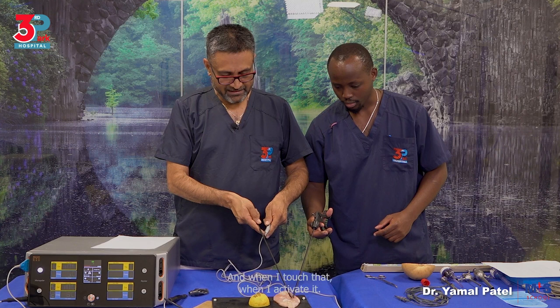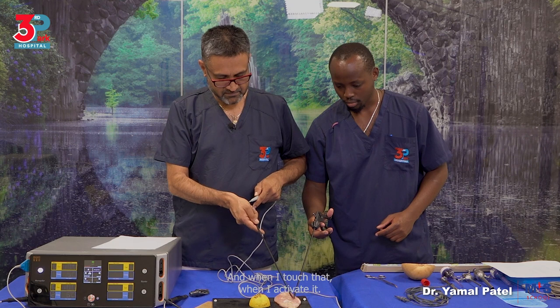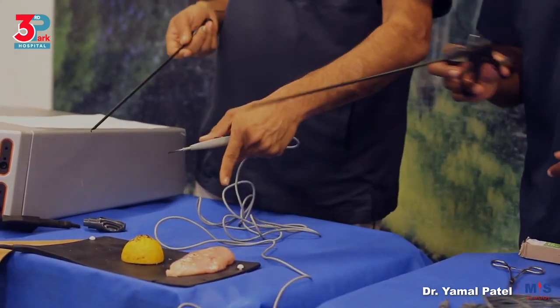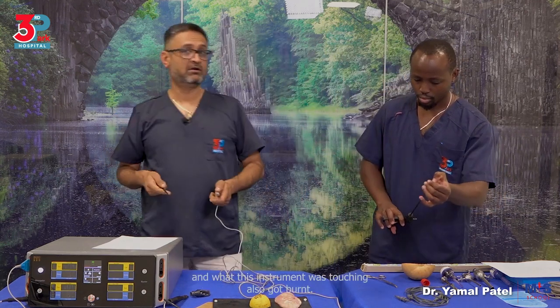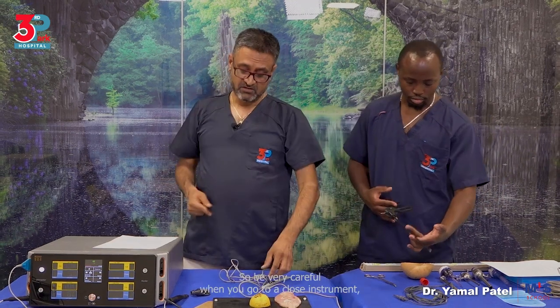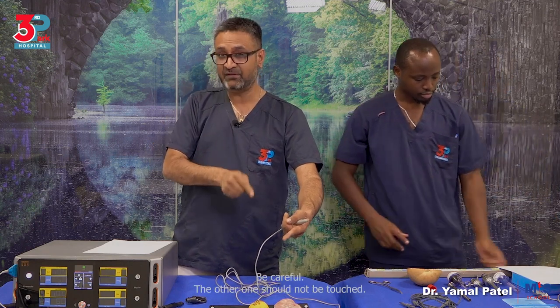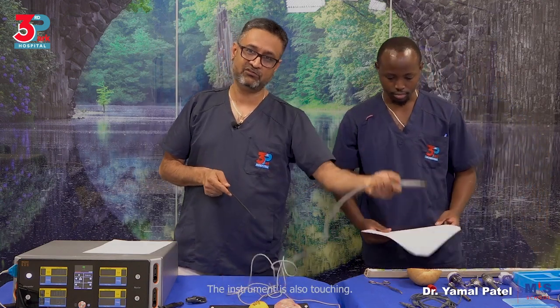I'm going close, and when I touch that, when I activate it, I made a mistake of touching the other instrument that this thing was touching. So what I was touching got burnt, and what this instrument was touching also got burnt. So it means that is direct coupling of these two instruments. So be very careful when you go to a close instrument, two instruments close to each other, and you're trying to use electricity on one. Be careful, the other one should not be touched. That will cause direct coupling and will burn whatever this other instrument is also touching.